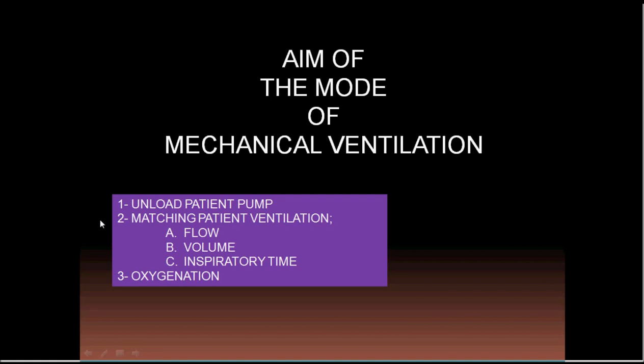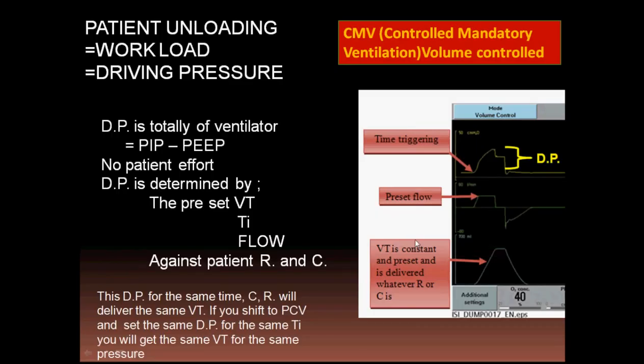Well, the aim of this mode is to deliver a fixed tidal volume to the patient. So look at this data. What about unloading the patient pump? What about the matching of the patient to the ventilator's flow, volume, inspiratory times, and oxygenation? For sure, this is controlled mandatory ventilation. The patient is not taking his breath, so it is mandatory. The breath is delivered from the ventilator itself.